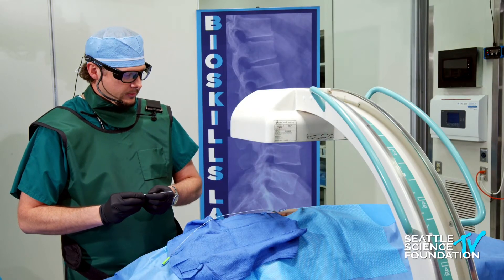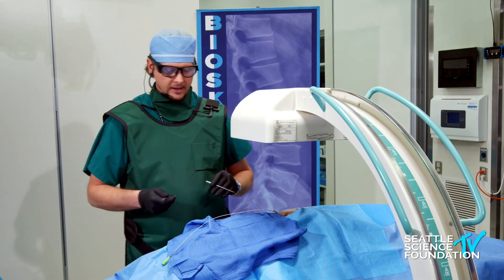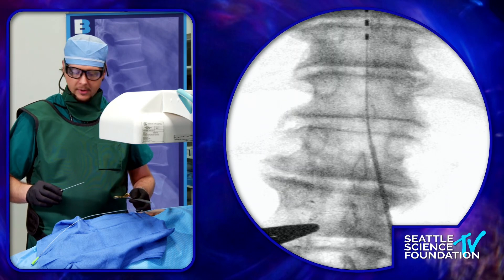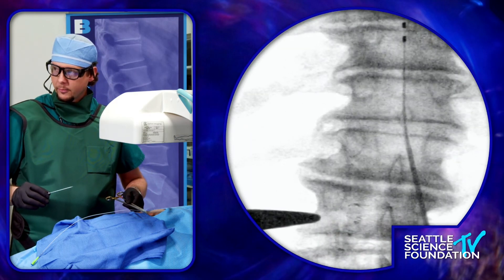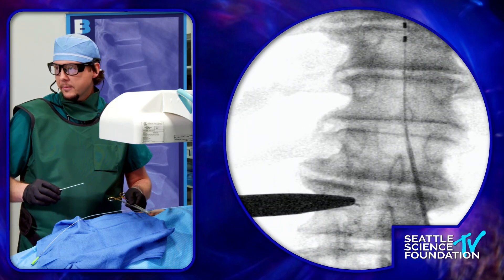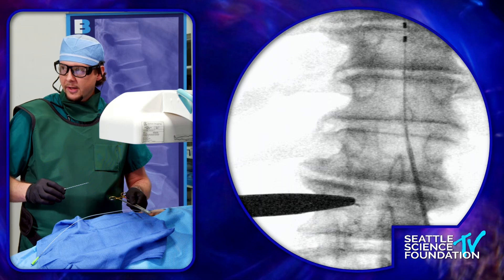We can go ahead and get started placing the second lead. We've got an AP view directly over with nice sharp end plates right there at T12-L1. You can see it's kind of right over the lower end of the disc space, top of the L1 vertebral body, right over the pedicle and the facet joint area.